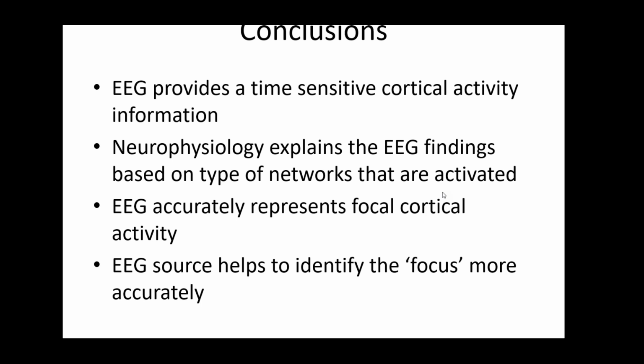So typically thalamocortical ranges are either alpha, theta, or delta range. Beta frequencies typically represent cortical activity. And so there are the classical thalamocortical networks or basal ganglia networks, like a mu rhythm, which is the basal ganglia with the premotor and motor cortex activity.